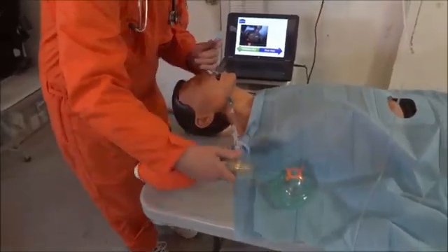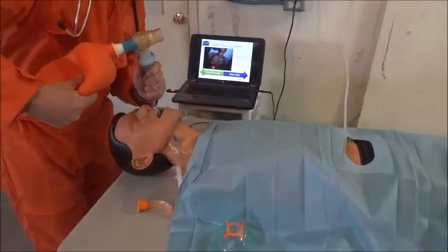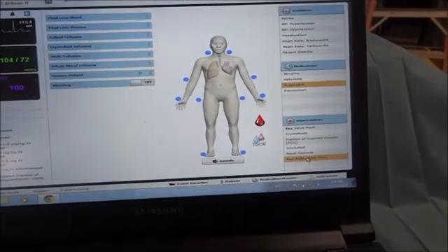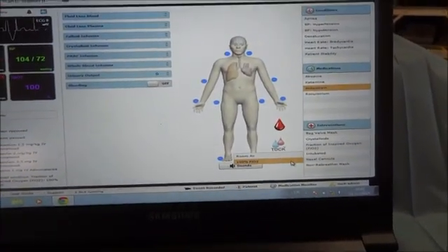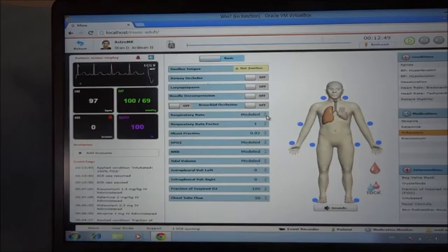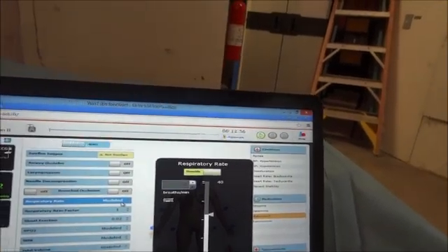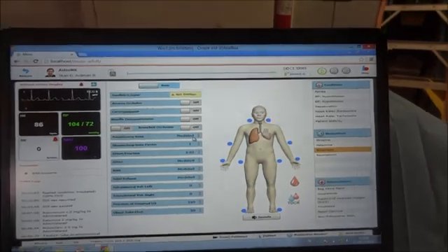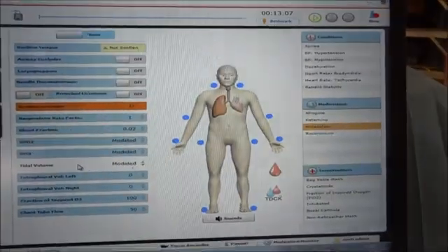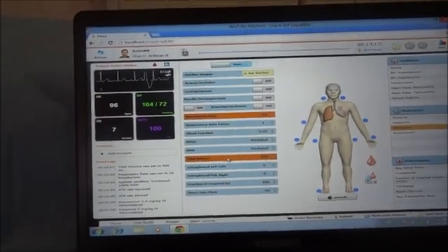Now it's time to test the intubation. Now that the mannequin is intubated, on the simulator I'm just choosing intubation with 100% oxygen, and I need to emulate the mechanical ventilation. So I'm going to set the respiratory rate to 16 per minute and the tidal volume to 500 milliliters. Now the patient is actually ventilated.